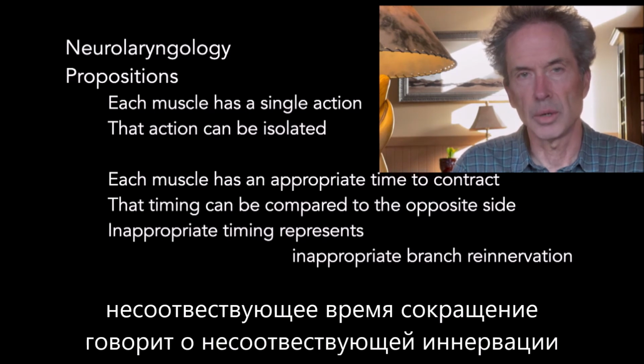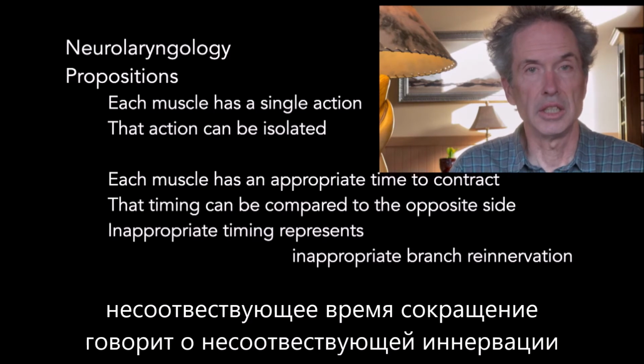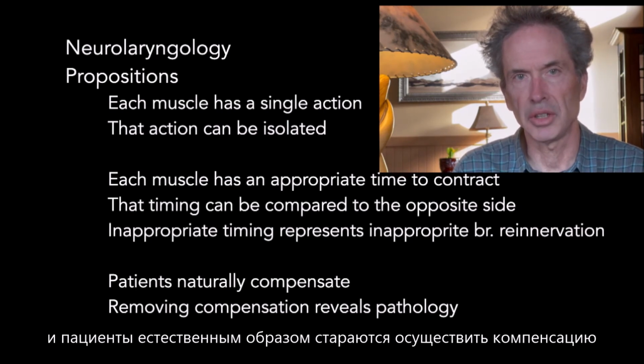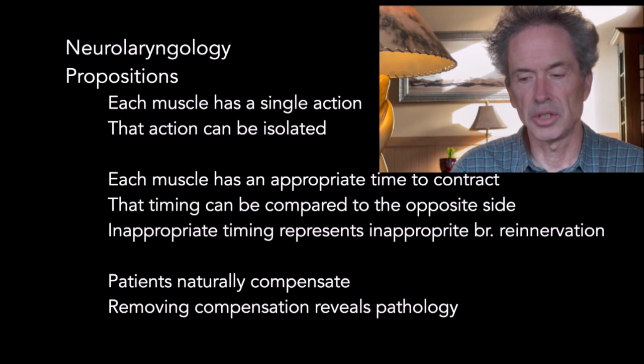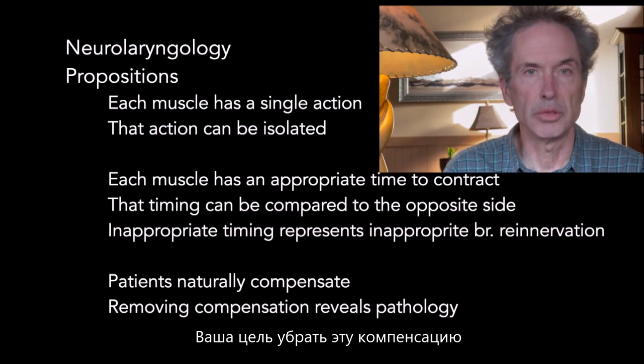Inappropriate timing represents reinnervation by an inappropriate nerve fiber, a crossover of muscle fibers after a nerve injury. And patients naturally try to compensate. Your goal as an examiner is actually to remove that compensation so that you can reveal the pathology.